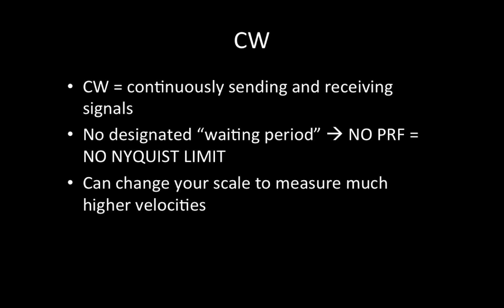So in contrast to PW, with continuous wave Doppler, you're continuously sending a signal and receiving along that line of interrogation. So there's no obligatory pause to wait and listen for return signals.